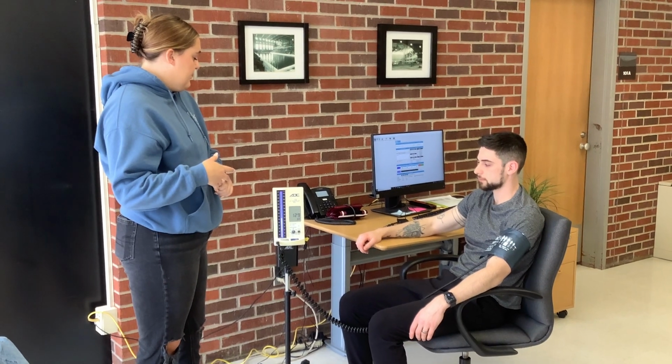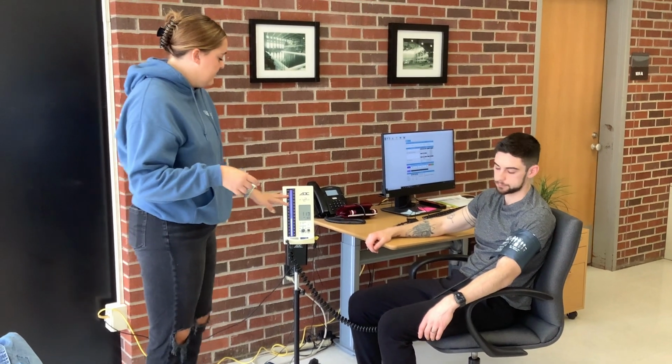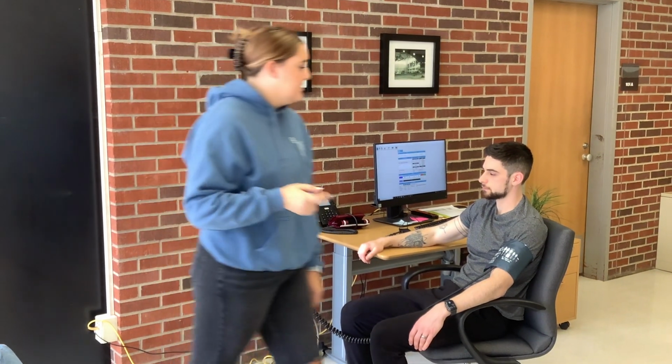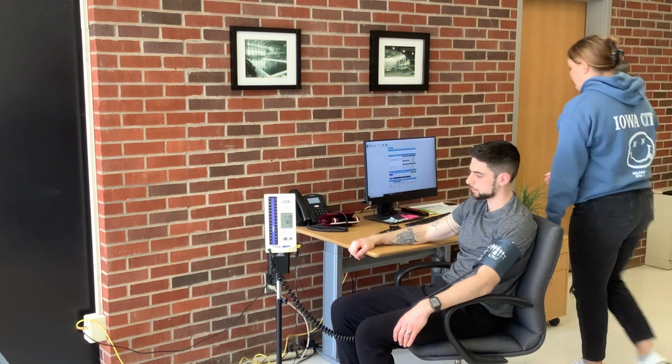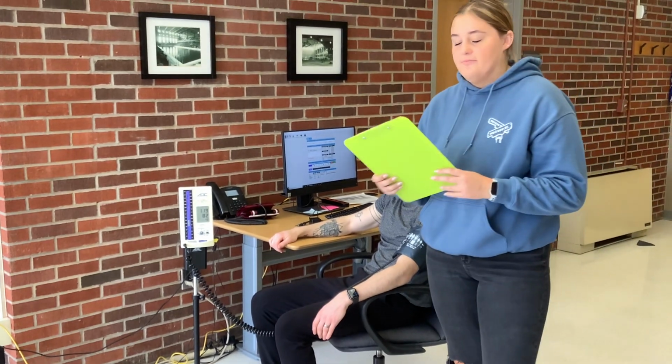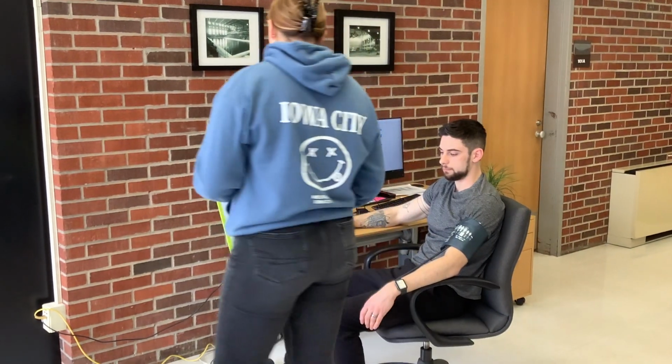Another thing to take note of too is you don't want them to talk while they're getting their blood pressure taken, because that can also cause it to increase and things like that. Typically while they're sitting here, if it's a normal reading, it'll be something along the lines of like 120 over 80. If it's 130 over 90, so if one of those numbers is higher than 130 or 90, then they're at an elevated blood pressure. So if that's the case, you'll have to fill out one of the forms here that we have just to let them know that it's slightly elevated.